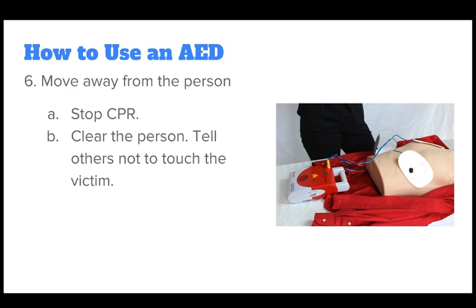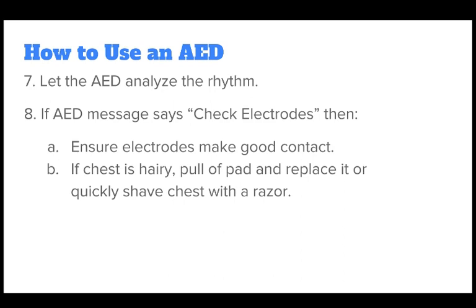Stop CPR. Let the AED analyze the rhythm. If the AED message says check electrodes, then ensure electrodes make good contact. If the chest is hairy, pull off the pad and replace it or quickly shave the chest with a razor.